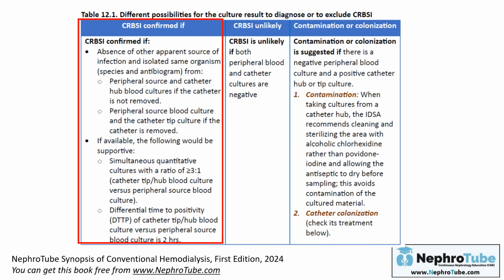However, some units use the same approach for the short non-tunneled uncuffed catheters, although the main line of treatment of infected short-term non-tunneled uncuffed catheters is catheter removal. However, some units, as I mentioned, use the same approach used for long-term cuffed catheters to manage the short-term infected catheters, especially in patients with previous access problems.